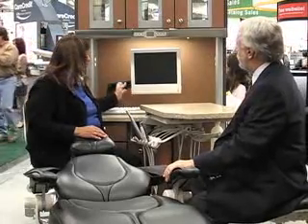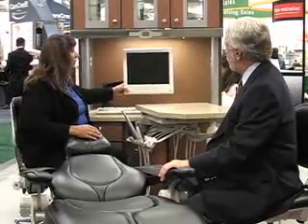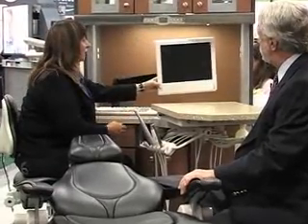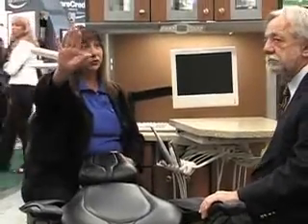Okay. And tell me about your monitor position and your computer position in the operatories. Well, we always recommend 2 positions for our monitor. This monitor that you see at the rear of the operatory is for charting and for patient scheduling. This can be operated by either the dentist on my side of the chair, or this arm can move to the assistant side of the chair as well. A second monitor would normally be located somewhere towards the toe of the chair or on a track mount, which was not shown in this operatory, which would be for patient viewing and patient marketing.